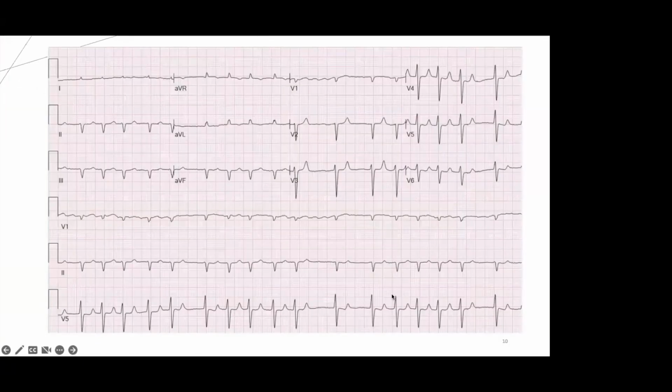So I'm going to move on to a patient case. This was a gentleman who was a trauma patient. And they sent just a general echo to do workup, see if there's a cause for syncope, et cetera. There wasn't really any history of amyloid diagnosis for him. And this is his ECG here.